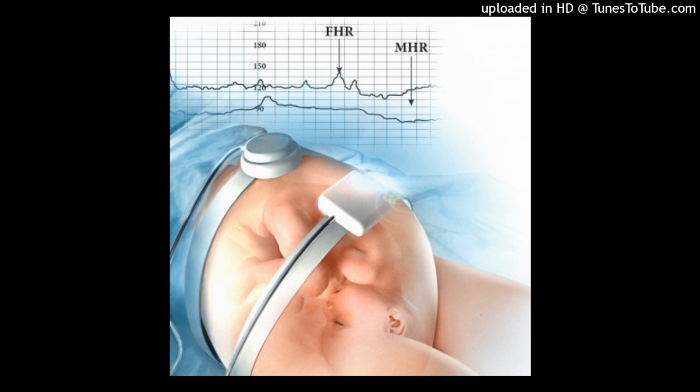External monitoring, also called indirect or non-invasive monitoring, can be used at any time because cervical dilation and ruptured membranes are not necessary for placement. Devices are held in place with either an elastic belt or adhesive patch that attaches to the transducer.